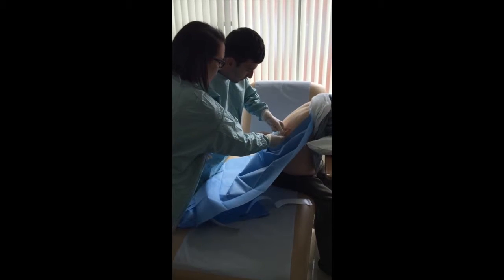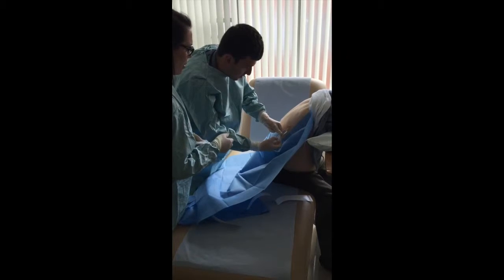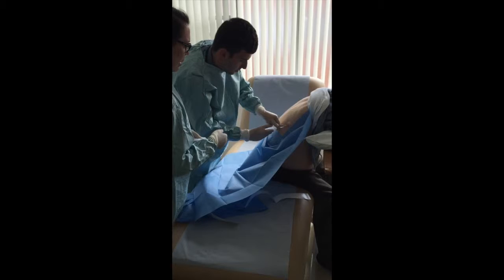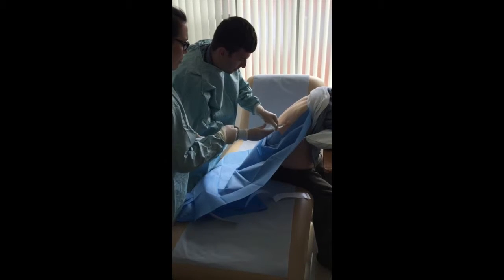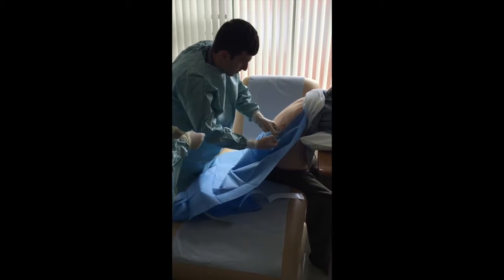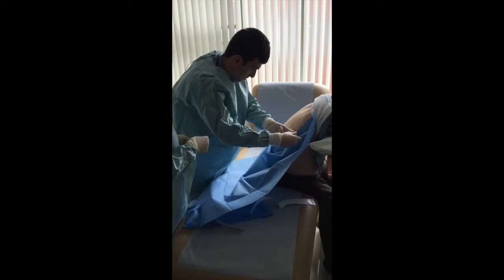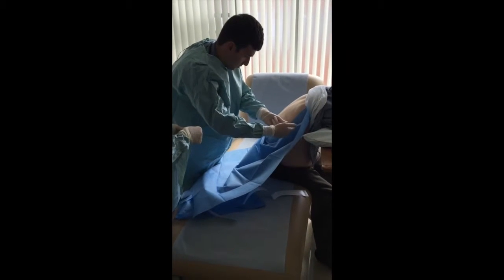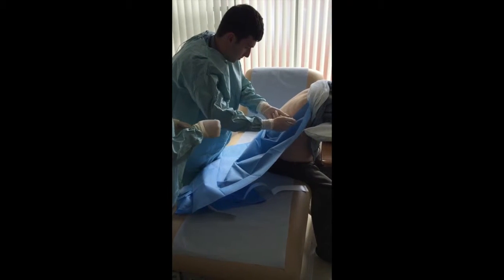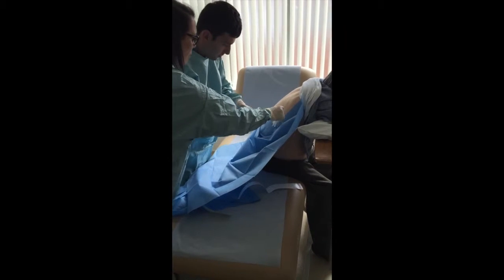And then if you just bring it up to 12 o'clock, what you're going to do is give it into the 4 quadrants. So aspirate and infiltrate into the 4 quadrants. You can just see the blood coming up there. And give some at 9 o'clock and give some at 6 o'clock. You okay there? Sorry, this is a bit stingy, this bit. Just come out with that now. And just give that a minute or so to work.